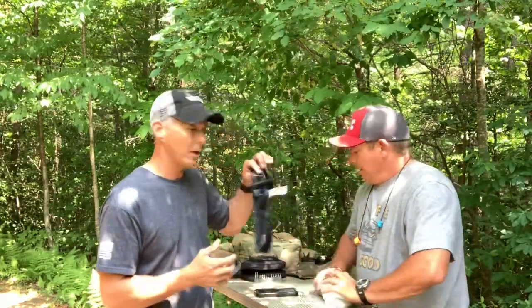Get this tourniquet set up right so that if you need it, you have the ability to do that. You've got to be able to use your teeth. You've got to be able to improvise to get one of these to work right, especially if you need to get it on your leg or something like that, and it was pinned and you couldn't just slide it over the extremity.